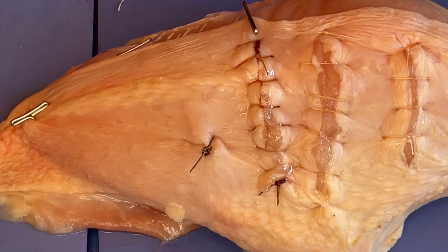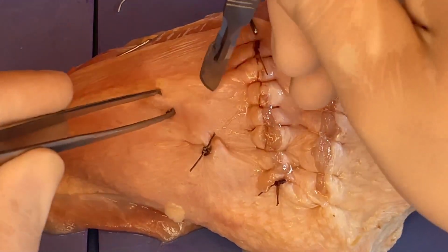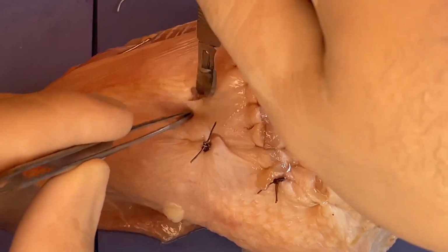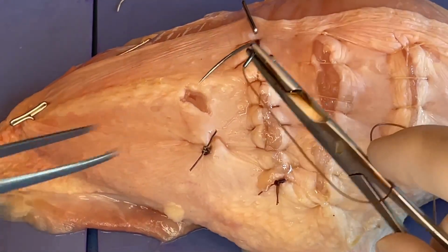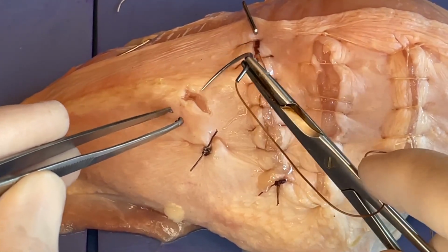We'll do 1 more of those here just to kind of highlight it. So let's make another little defect kind of here. So let's say we've got a little bit of a bigger area. And again, not quite enough length here to do a running.